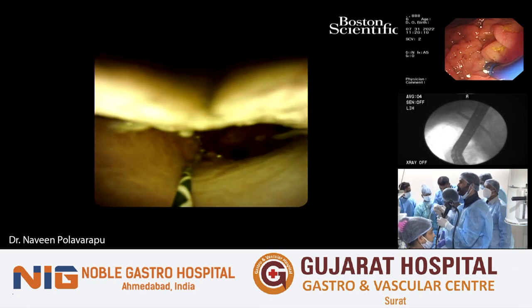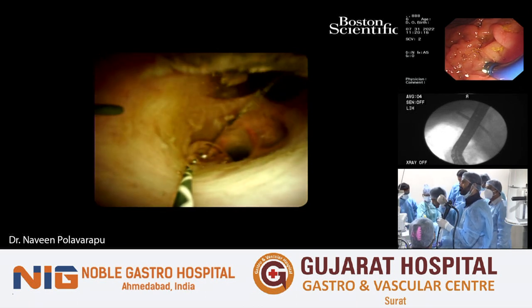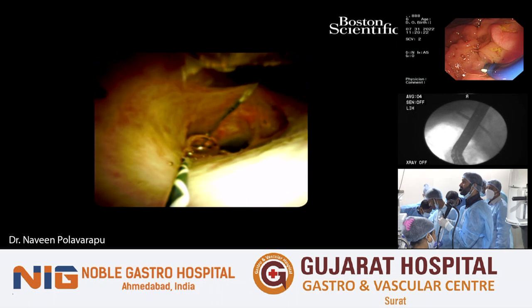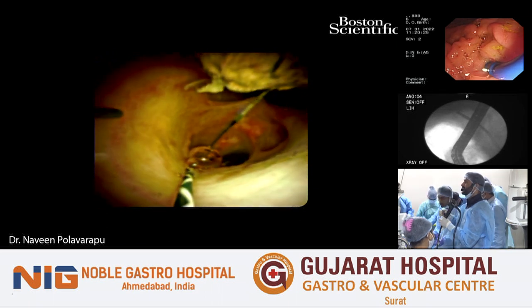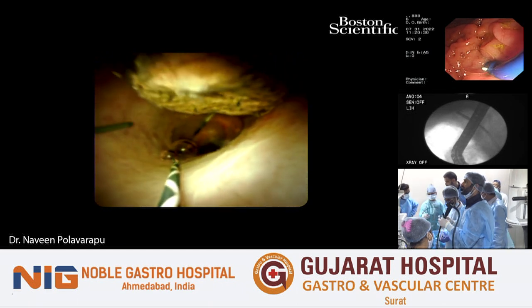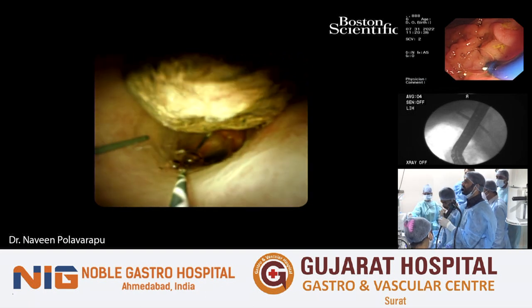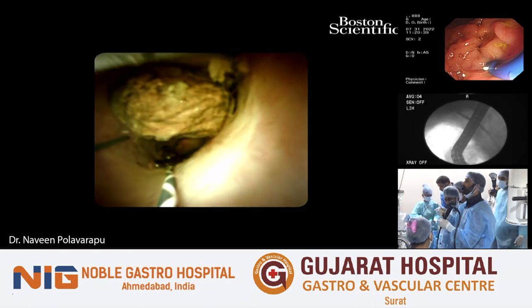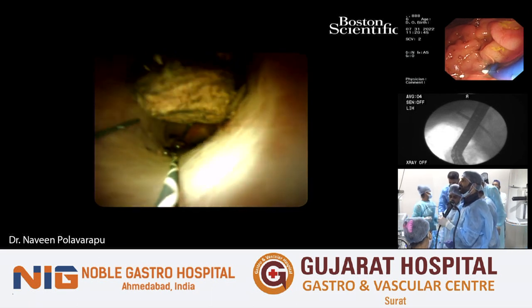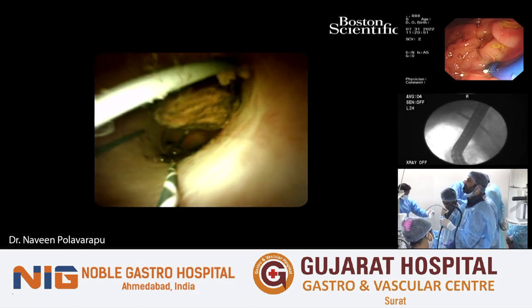If anything, you should not be forcing and pushing in. You should always follow with the guide wire. As you saw earlier, I was just pushing and then I got the scope. You saw the spy scope fall back in the duodenum. So I immediately noticed that it's just not feeding in properly. I looked at the duodenoscope side-viewing view and noticed that the spy scope was falling off. So you should not be pushing. That's the first thing we need to understand. The second thing is you should be gentle, and most of the times these bleeds are self-limiting. I have not encountered any variceal bleeds or any significant bleed where we had to use any endotherapies inside.